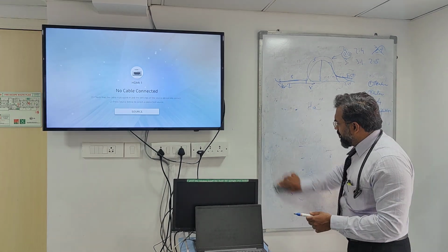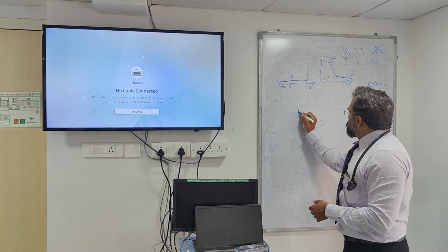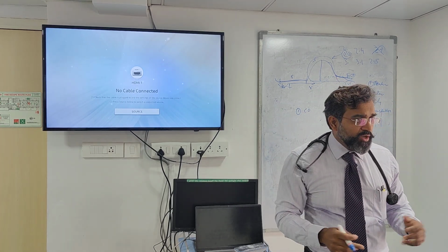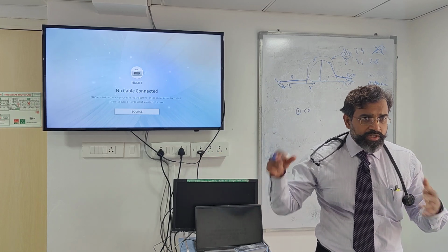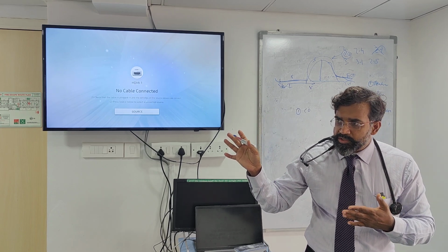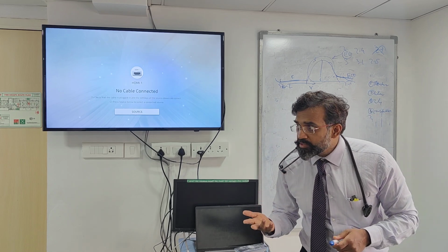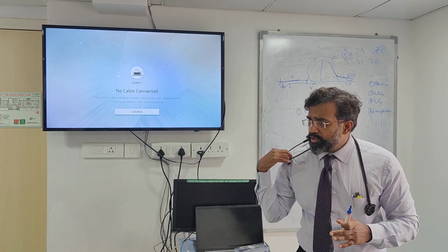I do have a few values which I'll clarify a little more. She's tried her best to clarify, but I'll make it a little easier. The first value I am very interested in is cardiac output. We are taking it from the Stewart-Hamilton equation and getting cardiac output. The other equation is APCO, arterial pulse contour analysis, which is Wesseling's equation. The main equation is the Stewart-Hamilton equation, which is based on temperature decay. Combined together, they give you continuous cardiac output monitoring.